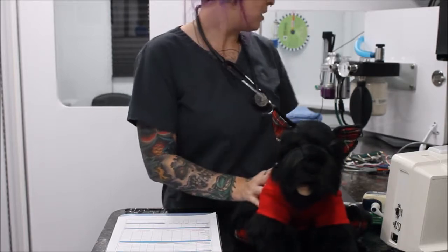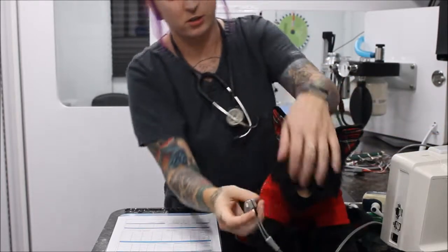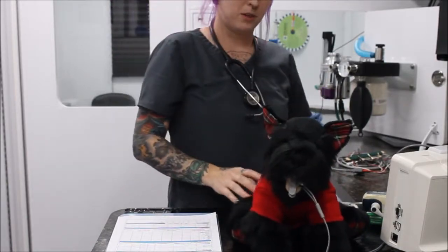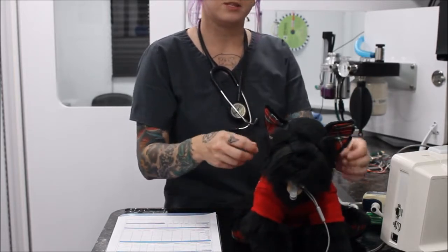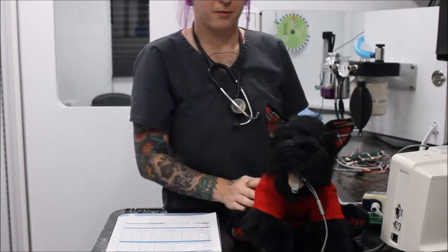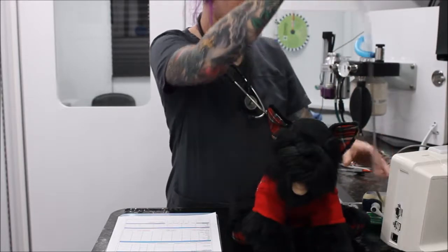But usually we'll have our SpO2 monitor on our patient as well, usually on the tongue, though it doesn't always have to be on the tongue. We should notice a drop in our SpO2 before we end up noticing the delay in the capillary refill time. So again, these are good monitors to help us.